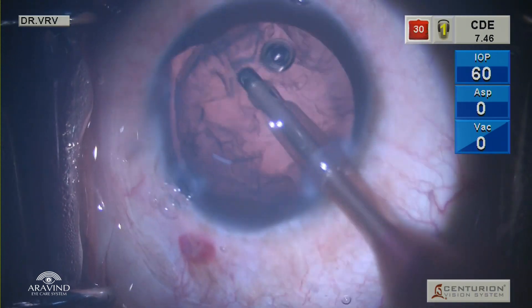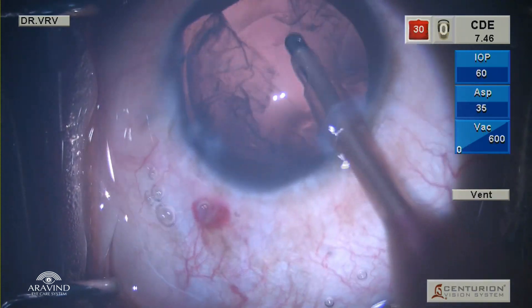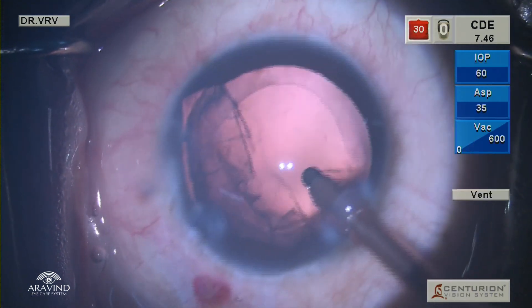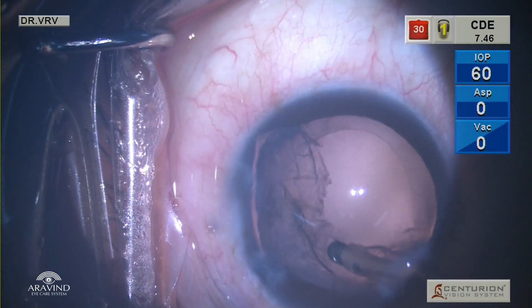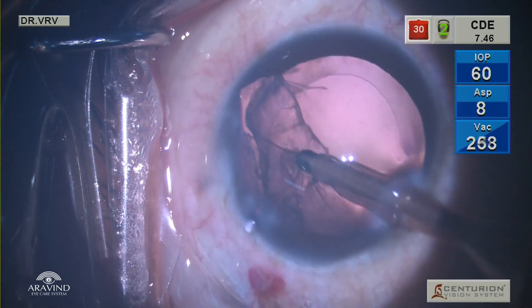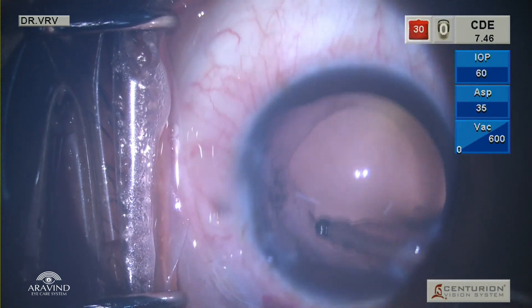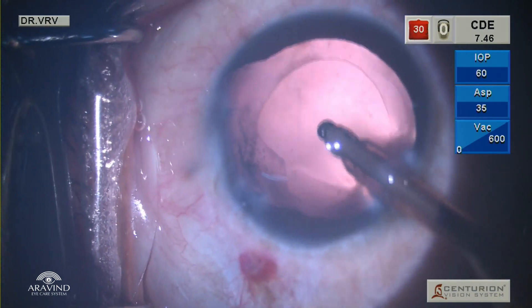Always initiate the cortex wash in the areas where the zonules are very strong. In this particular case, cortex wash is initiated nasally first; once the nasal cortex is removed, superior cortex is removed, and then the sub-incisional cortex is removed. Lastly, cortex wash is done at the area of zonular dehiscence. The key tip here is: do not pull the cortex radially as it can worsen the zonular dehiscence and lead to vitreous disturbance. Instead, always catch hold of the cortex and move your probe tangentially along the rhexis margin so that we do not worsen the zonular damage.